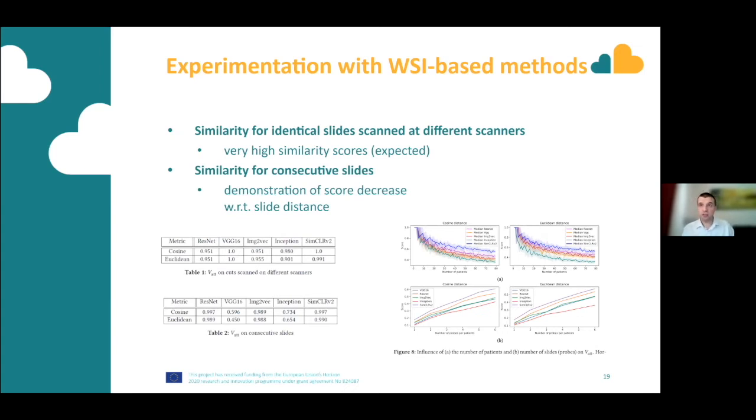But even spatially related slides are still relatively identifiable if you have consecutive or next to consecutive slides. And that still creates pretty high risk for sharing such data as anonymous material in different data sets.